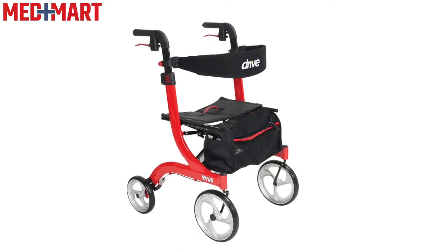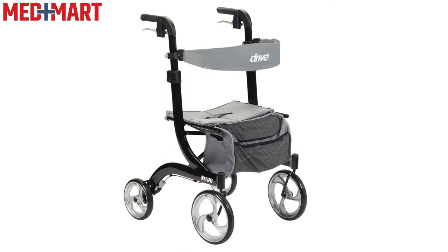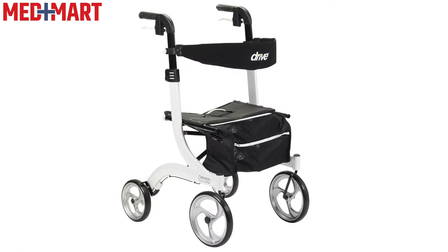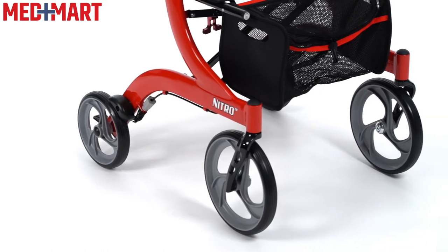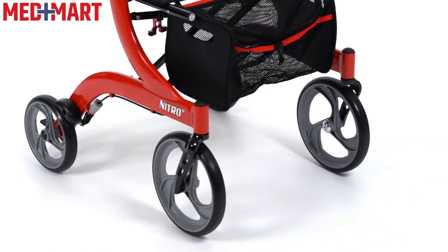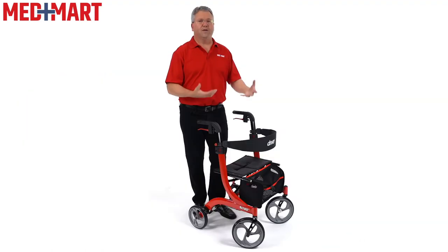The Nitro Rollator comes in three colors — we have the red as you see here, we also have black, and white is also available. So you have three different options to match your style. This features oversized front wheels and a little bit smaller back wheels, which in combination makes it a little bit easier to roll over some rough terrain and easier to steer in some situations.